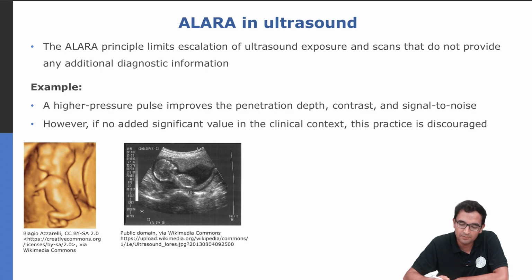One common example is that a higher pressure pulse actually improves the penetration depth, contrast and signal to noise ratio, right? But you may not be interested in very deep targets anyway. So, in that sense, we should not increase the pressure amplitude because it does not give you any advantage.